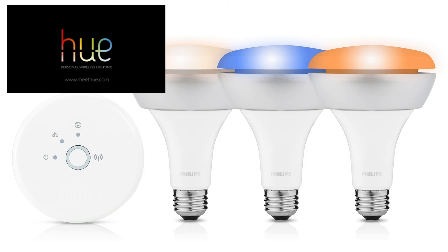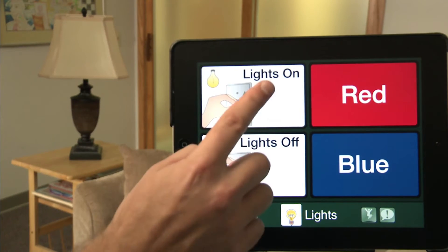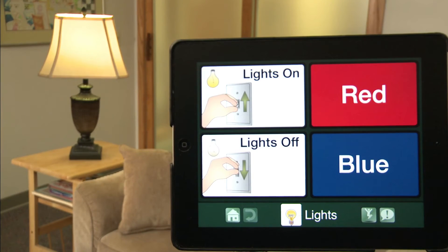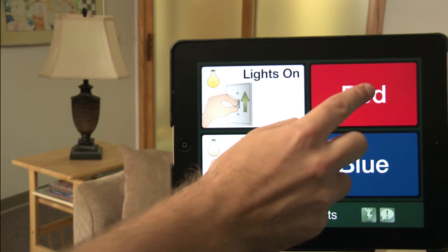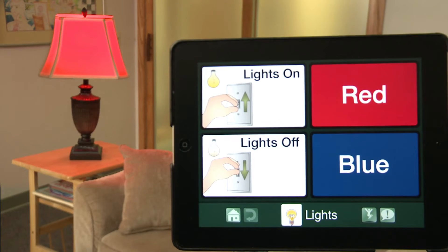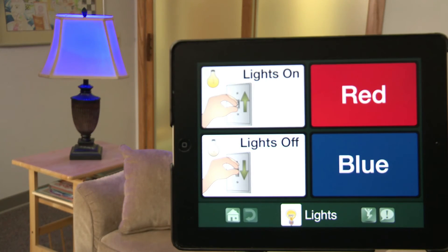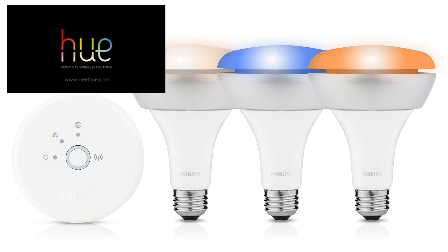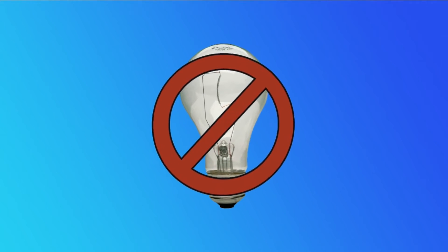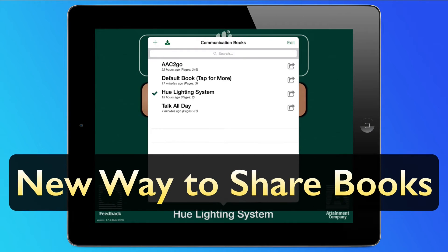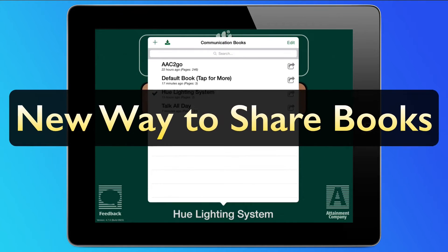GoTalk Now is now compatible with the Hue lighting system from Philips. Customize buttons to turn lights on and off, or change them to various colors. Please note, this feature works only with the Philips brand Hue lighting system, and not with standard light bulbs.